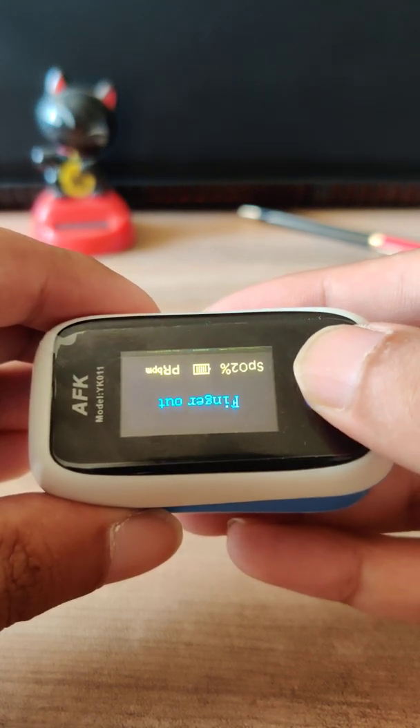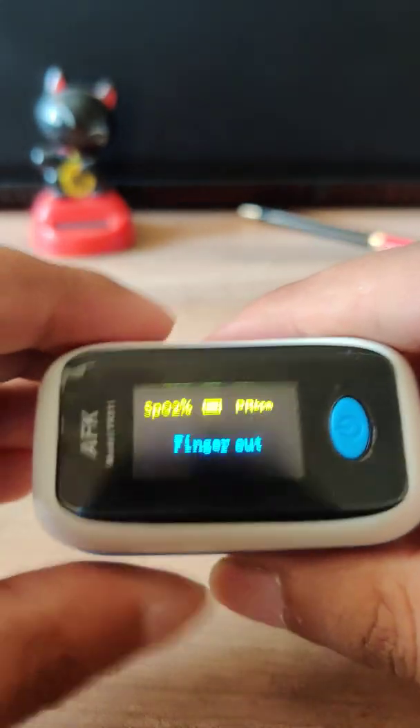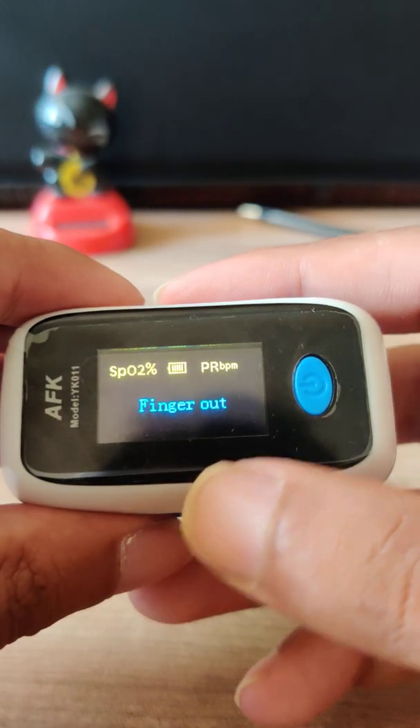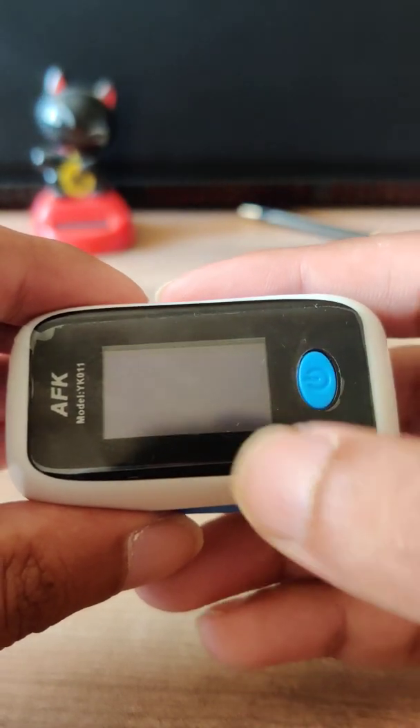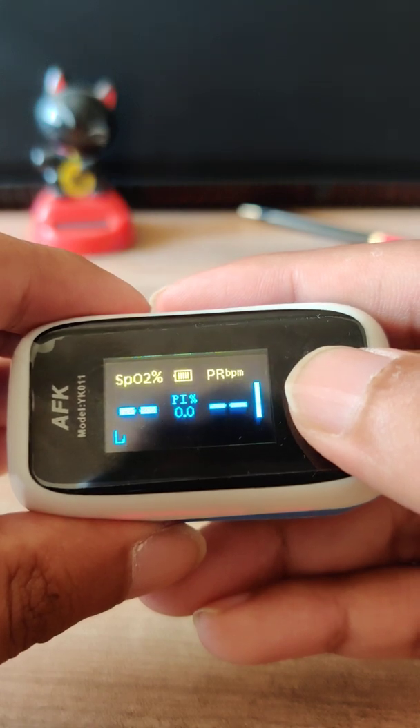I'll press the on button — it keeps changing the display. This device has an auto shutoff of eight seconds, so it will switch off within eight seconds.